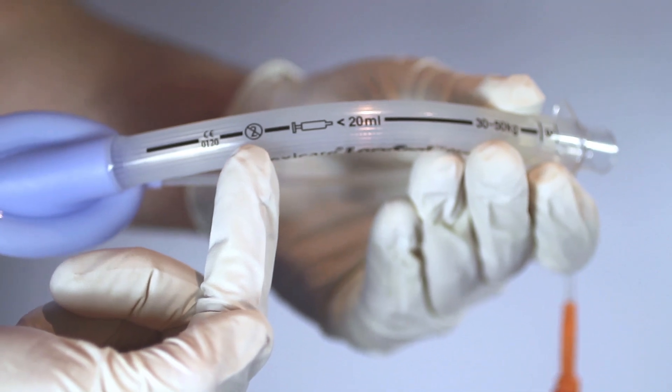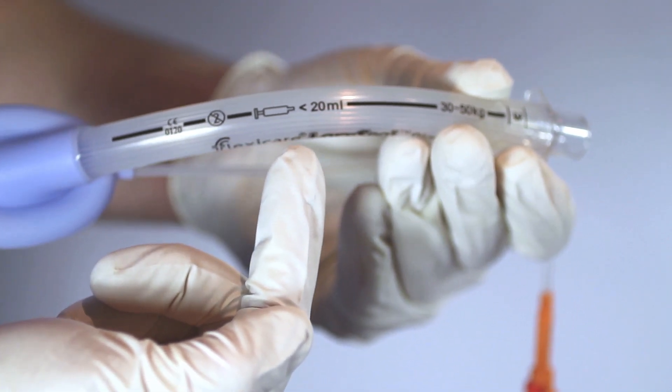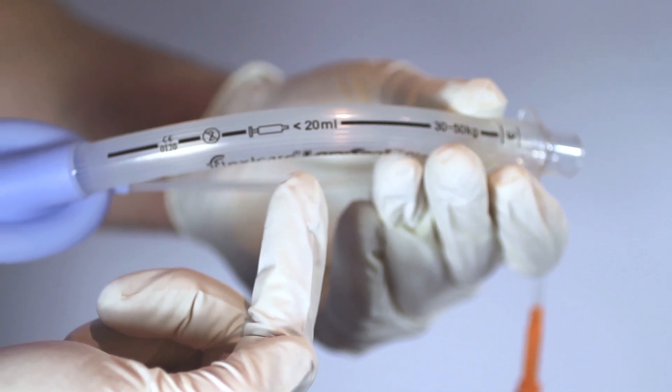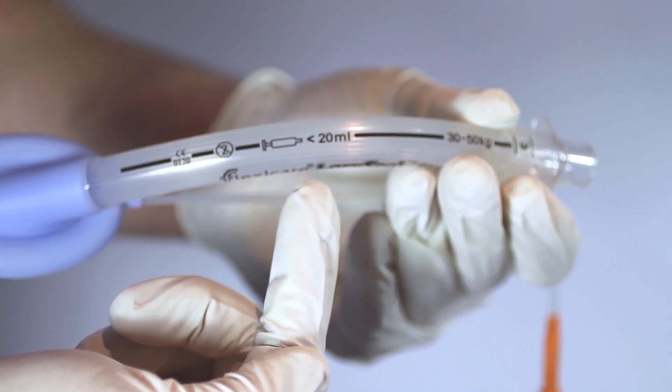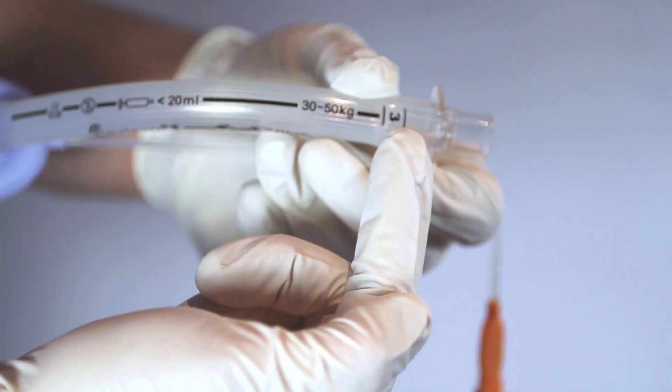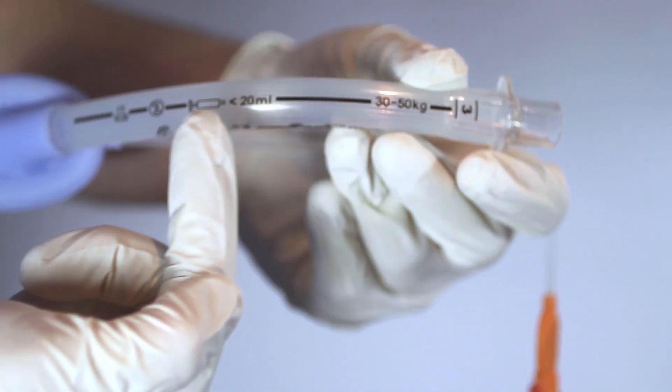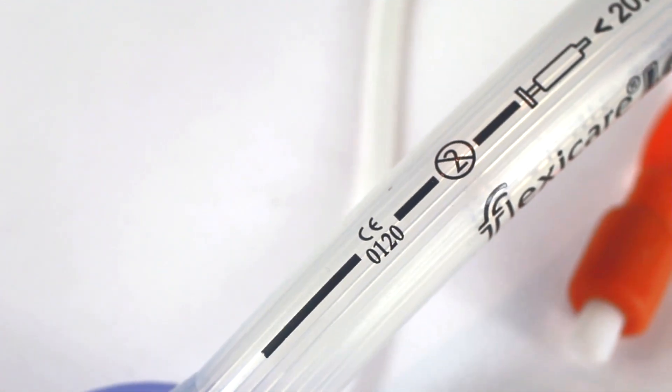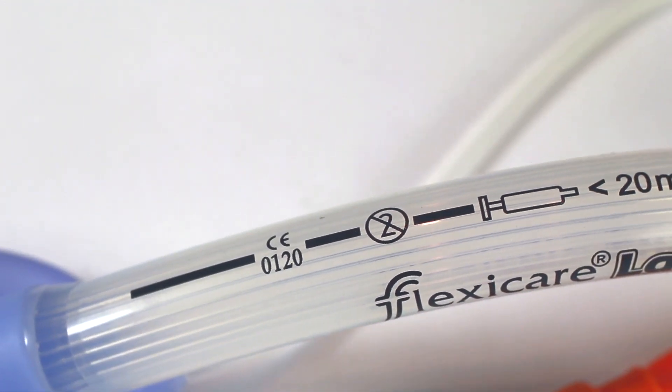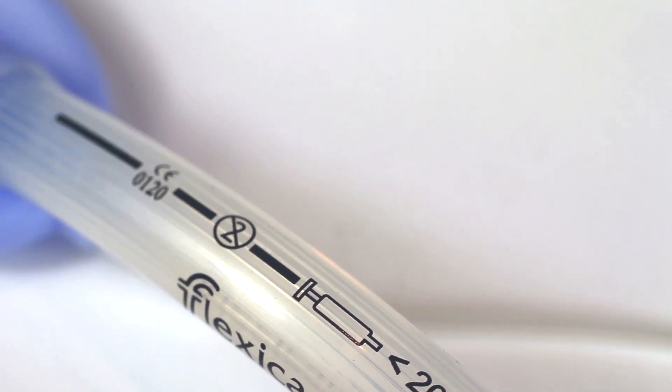The Laracel Blue single patient use stipulation is reinforced as is the maximum volume of air to be inserted into the patient cuff. The black line that you can see running up the center of the laryngeal mask assists in the correct placement of Laracel. With the black indicator aligned to the septum of the nose you can be certain that the main tube and cuff is not twisted and that an optimum seal may be achieved.